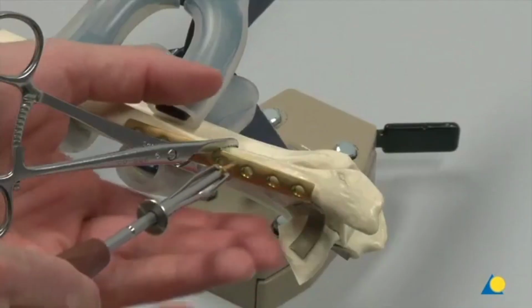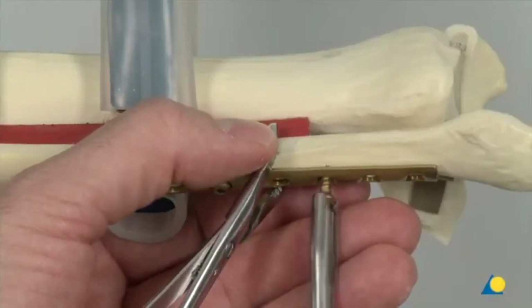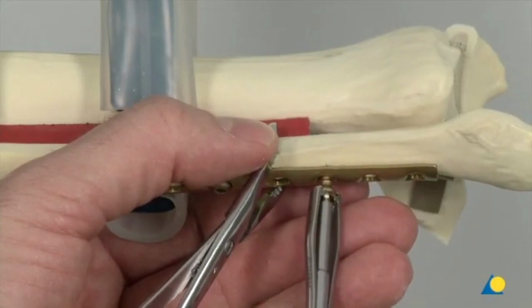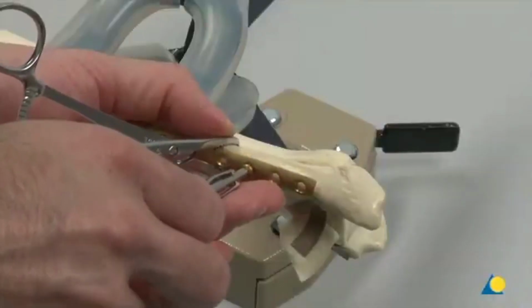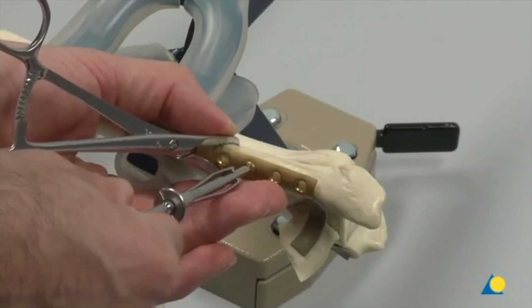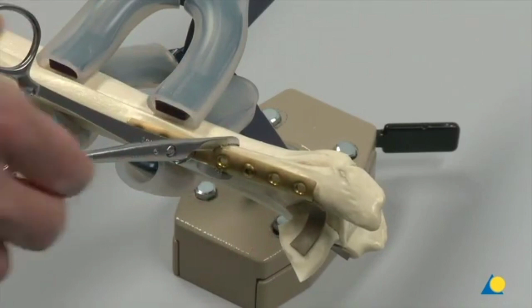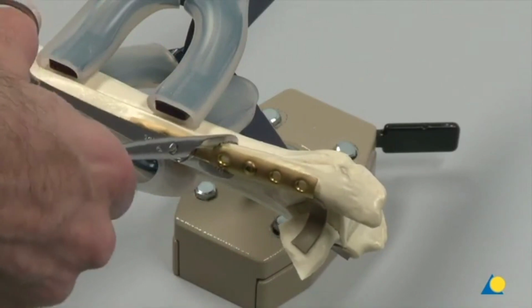The 3.5 mm self-tapping screw is inserted into the drilled hole, resulting in axial compression. As the eccentrically placed compression screws are tightened, the head moves down the ramp in the plate hole and compresses the bone together. The toothed reduction forceps is removed.